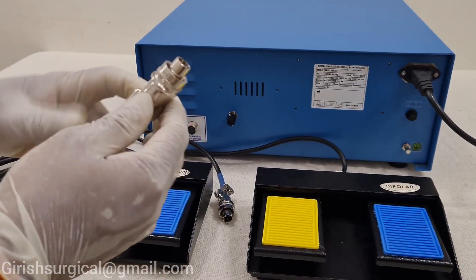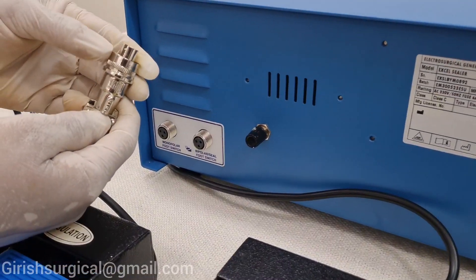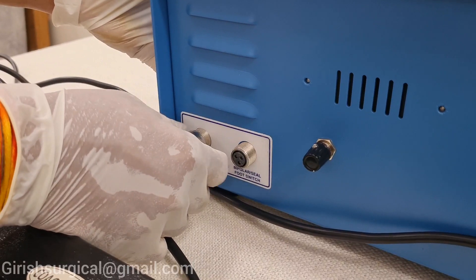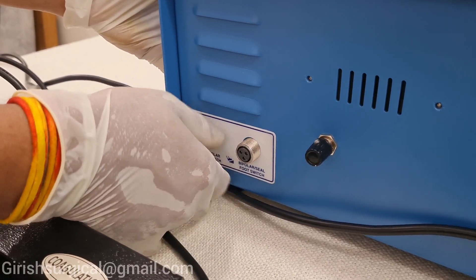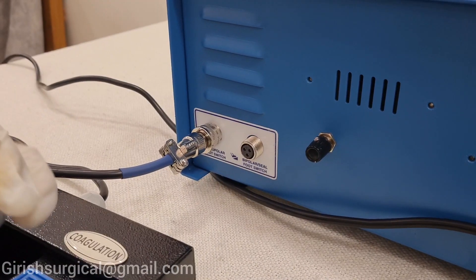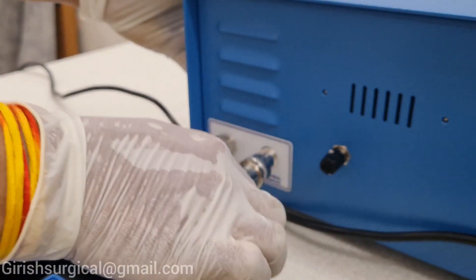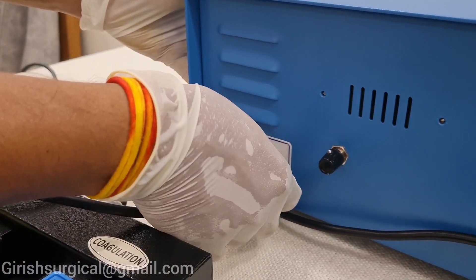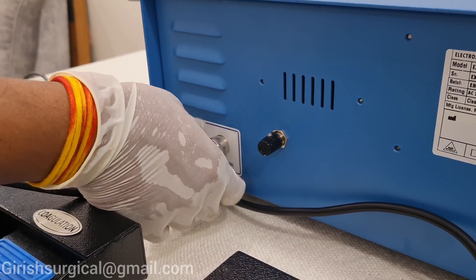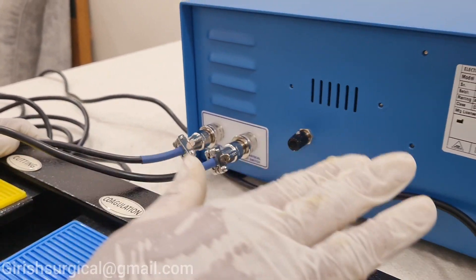In this there is a connector which you have to insert into the monopolar foot switch. Here the slot is there — this slot should match the connector and you have to tighten it properly; it should not be loose. The second port is used for the bipolar and the seal. Even here you will be getting a slot — insert it into the footswitch connection and tighten it properly. Both footswitches — monopolar and bipolar — are now connected.